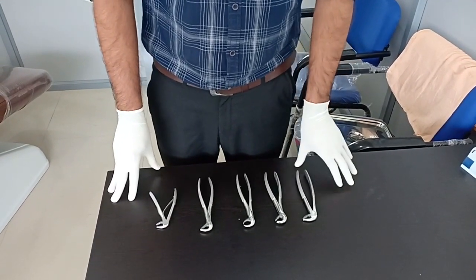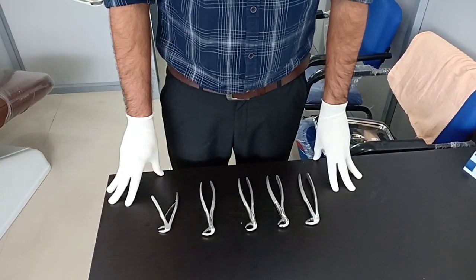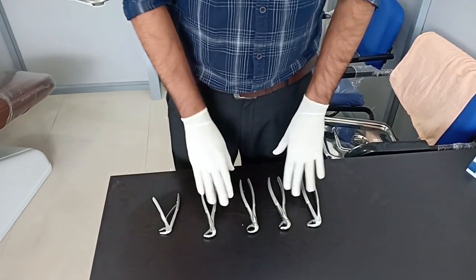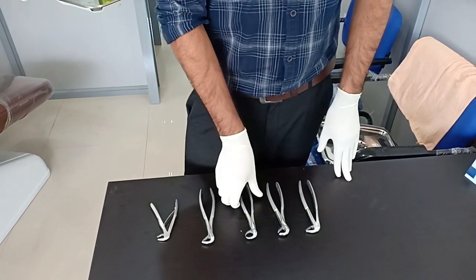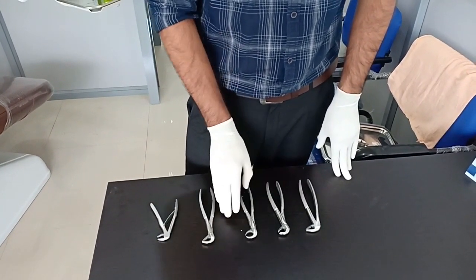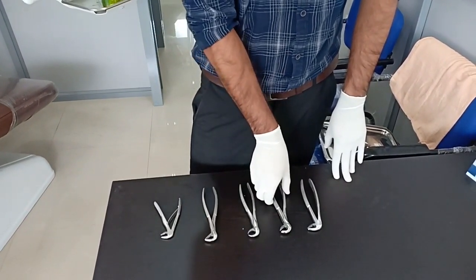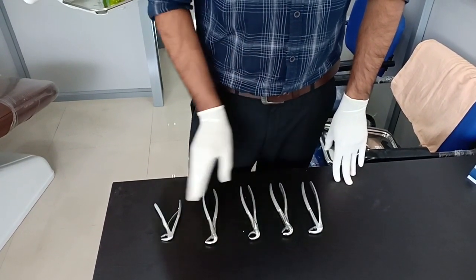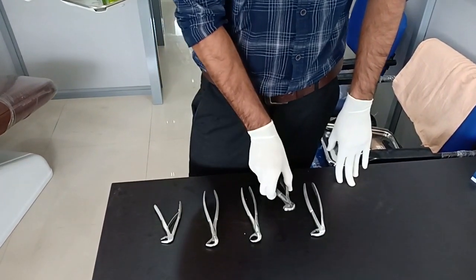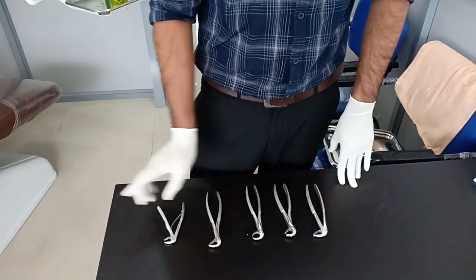We don't have as many varieties in the mandibular section like maxillary forceps. We have very few because there are no paired forceps for mandibular molars, and even for cow horn, we have only one cow horn and one mandibular molar forceps. Unlike maxillary, which has right and left molar and right and left cow horn forceps.